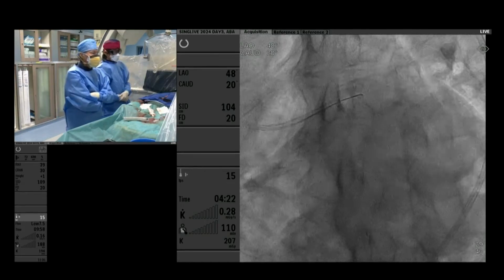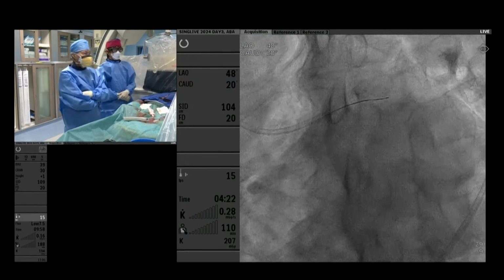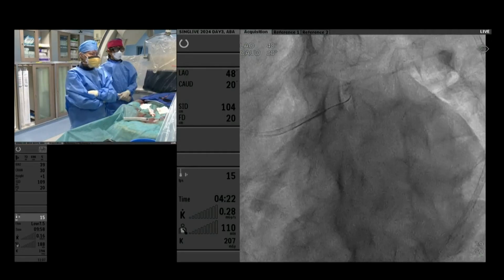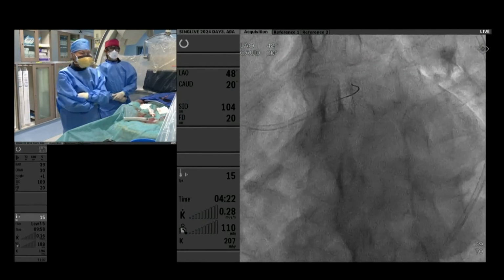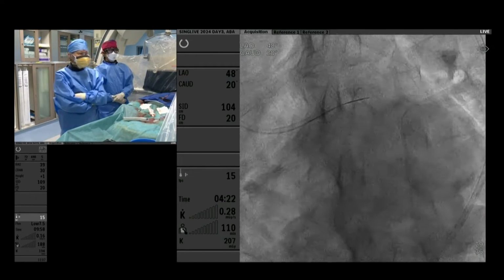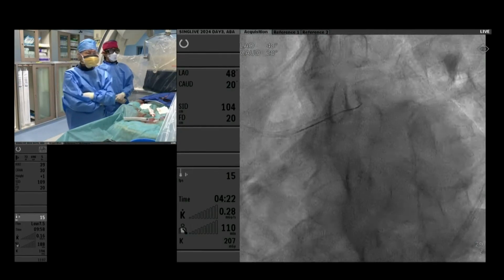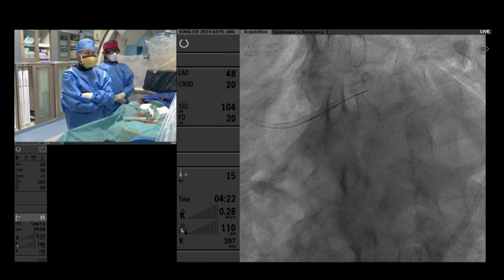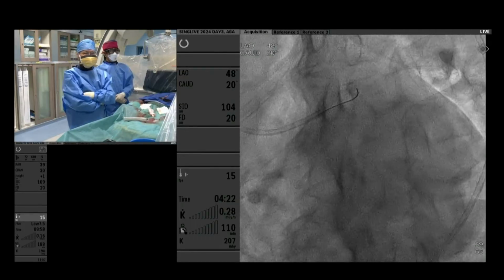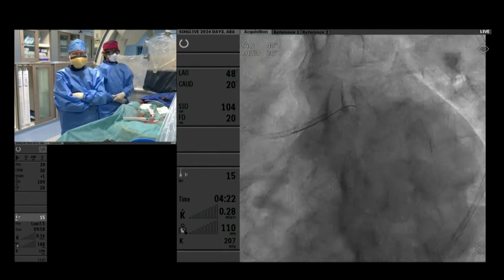Yeah, thanks very much, Prof. Koh and Jonathan, for sharing this case. I'm Hiwa here. Just want to ask, because I understand that you are using the Philips system, so one of the considerations would be to use the roadmap to do the wiring, you superimpose the image. And of course, we're going to ask our Stella panels what they're going to do in terms of reducing the risk of CIN for this patient. So I think if you aim for ultra low contrast PCI, you will limit your volume of contrast according to the eGFR, means that in your case it will be 50 mils or less.